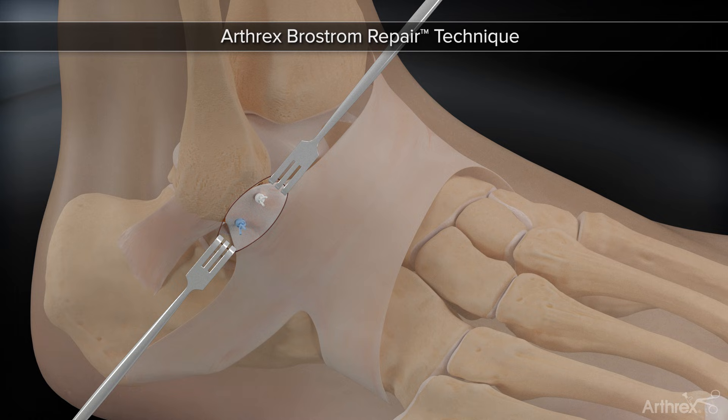This completes the repair. The Arthrix Brostrom repair provides multiple advantages including a minimally invasive technique and a time-zero construct strength equivalent to the native ATFL. For surgeons performing an ankle arthroscopy prior to the repair, the all-arthroscopic Arthrix Brostrom repair can be performed utilizing the same Arthrix Brostrom repair kit.